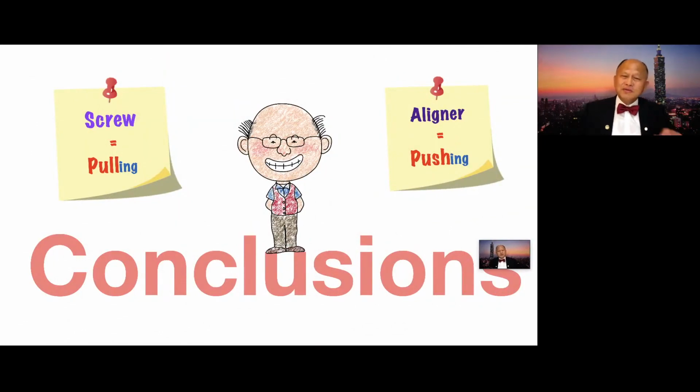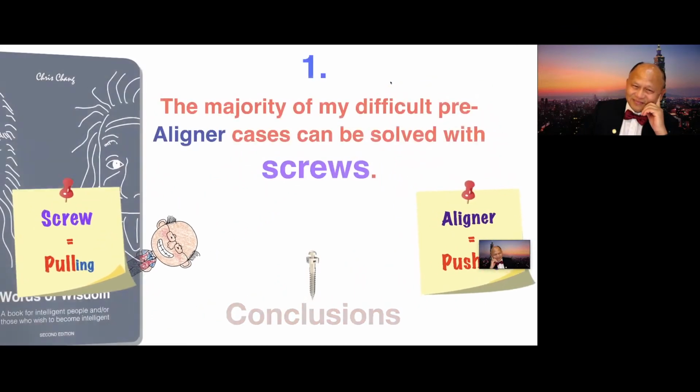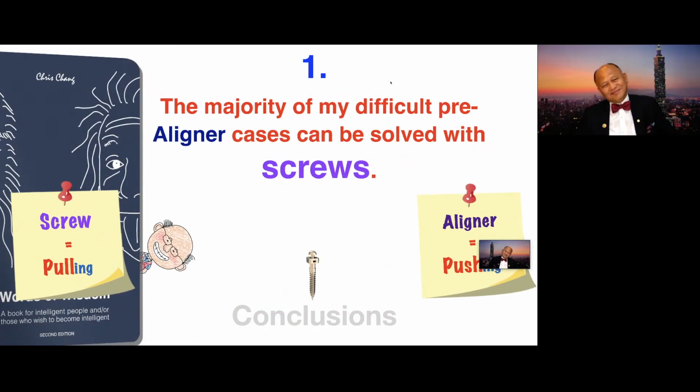To conclude my lecture today, conclusion number 1. The majority of my difficult pre-aligner cases can be solved with screws.